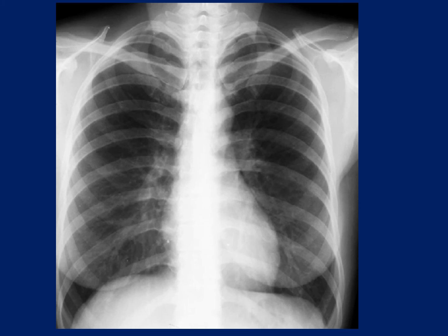The heart border here is not greater than 1/2, so you're looking at the white part there where the heart comes out on the patient's left side again. All this other little haziness here is vessels in the area. You can see the spinous processes on the x-ray, so this is probably a PA film, so you're looking at the picture from the back. You can see the clavicles, you can see the scapulas here on both sides.